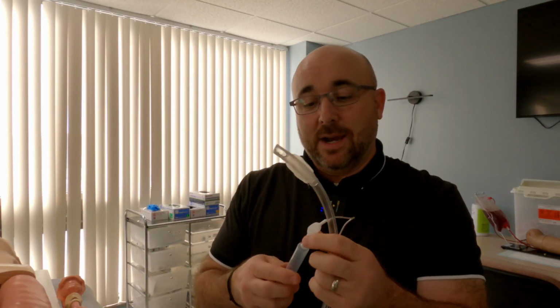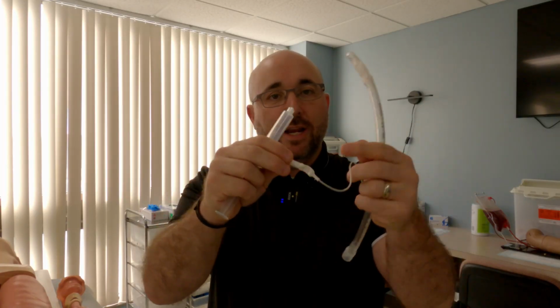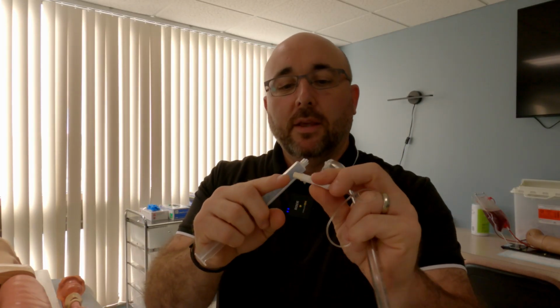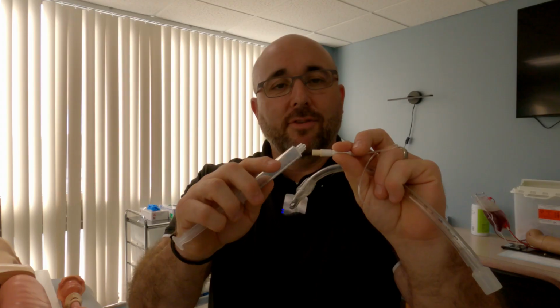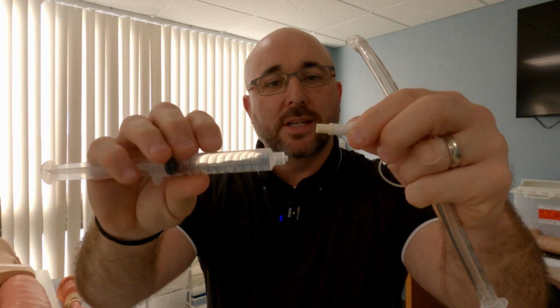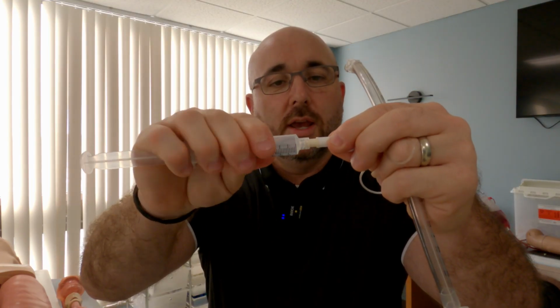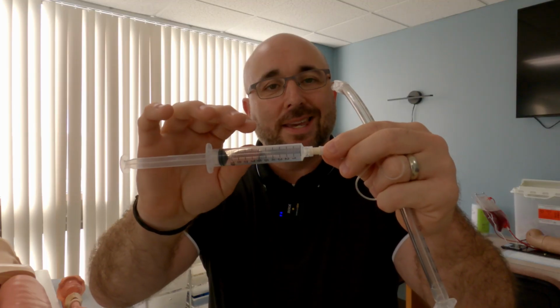So this seals inside the airway. This is the endotracheal tube cuff. And so how do we test that? We take out a 10 cc syringe, you apply it to this little piece that hangs off right here. This is kind of like a luer lock, if you will, and there's a spring inside of there. So this doesn't screw on. As you can see, there are no actual threads on there. So we just kind of push it on and do a little rotate, plastic on plastic, and it holds really tight.